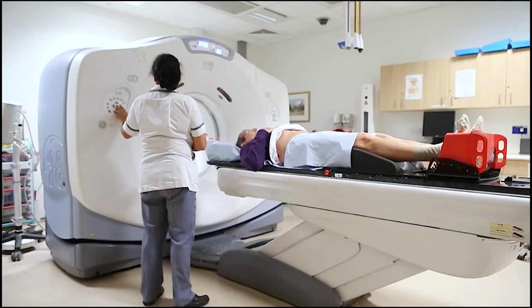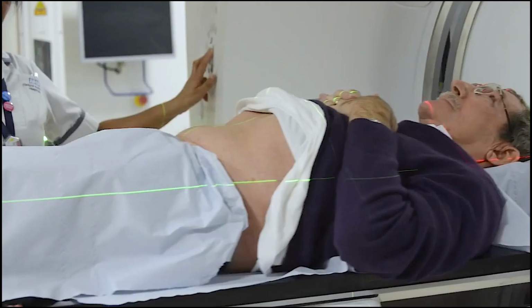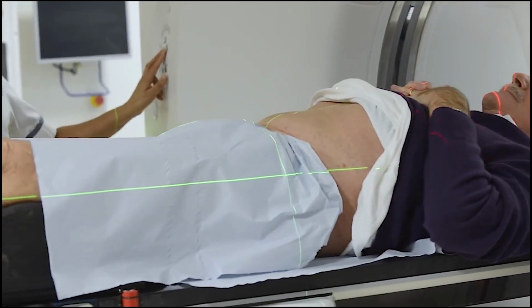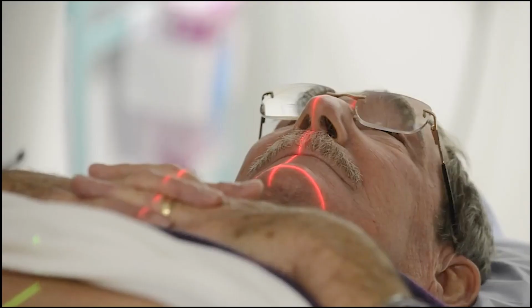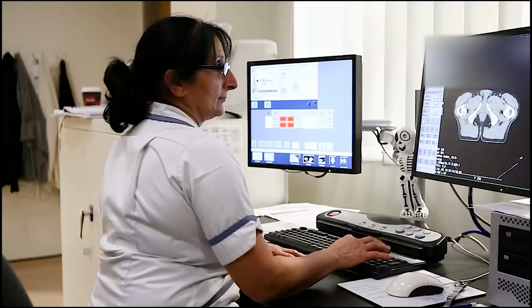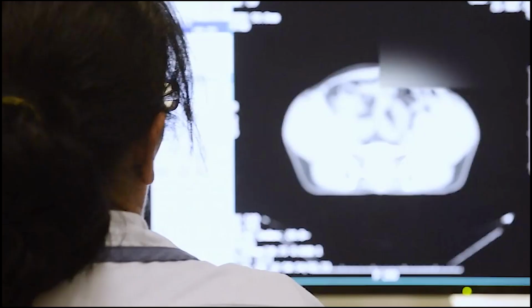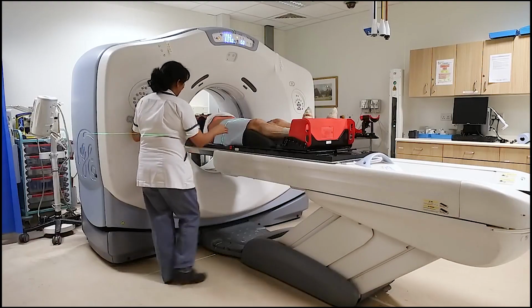After the CT scan, you'll be given some permanent radiotherapy tattoo dots. They are very tiny. You might not be able to see them, but they'll definitely be there. The tattoo dots shouldn't hurt. You'll just feel a sharp scratch while they're being done. On the CT scans where they put the implant or check the implants and put your tattoos on, they also do an ultrasound on your bladder to make sure that your bladder is actually full while they're doing it.